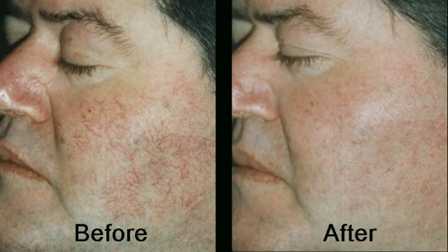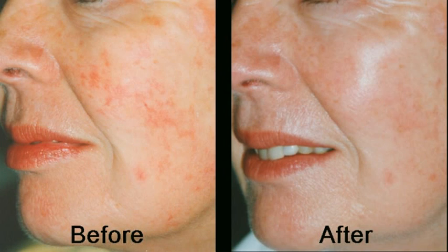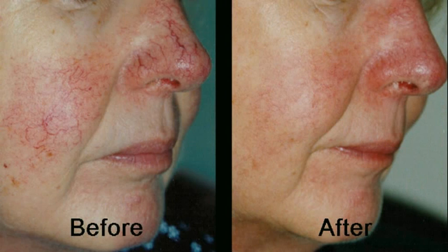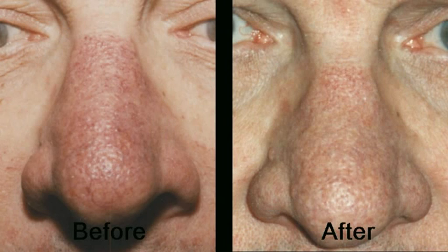An experienced dual yellow laser therapist should be able to offer a patient the expectation of 75 to 90% reduction in facial telangiectasia in one treatment. Exceptions occur with active or florid rosacea, systemic steroid use, and darker skin types. Nasal vessels respond well, but are prone to recurrence, which is a feature of the pathology and not a failure of the laser.